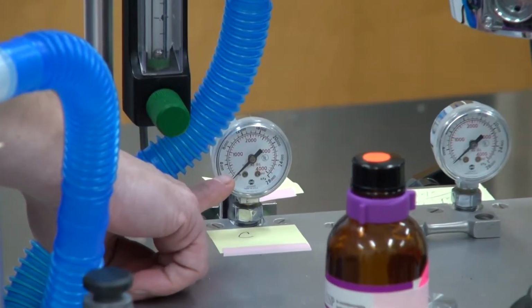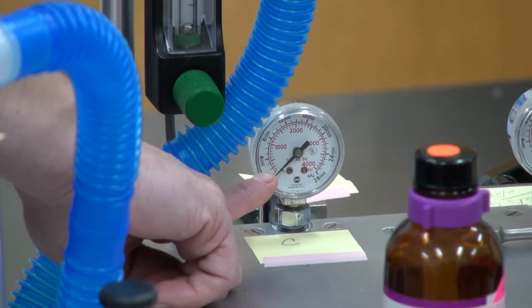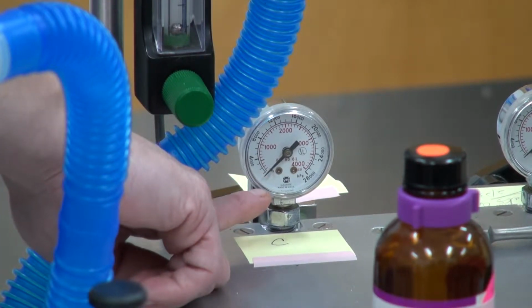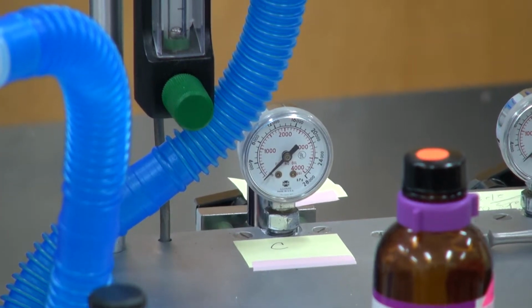Pressure. That is our pressure gauge. If we have a full tank, what is it going to read at? 2200 what? PSI. Correct. When am I in the danger zone when I need to change my tank? 500. Correct. Okay. D. What's D?